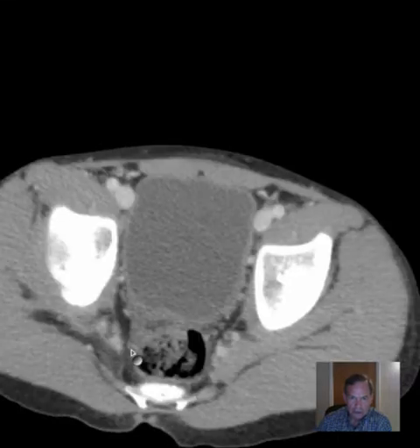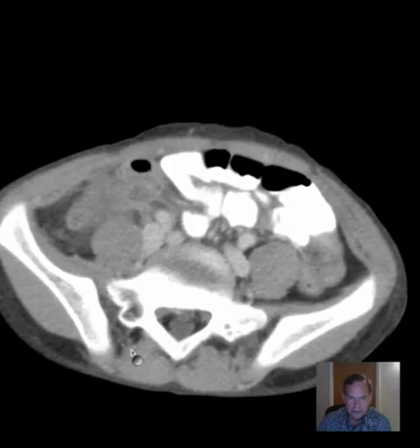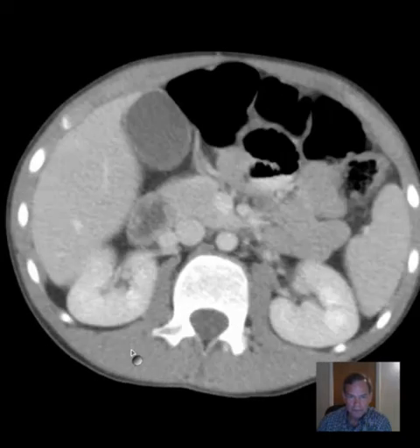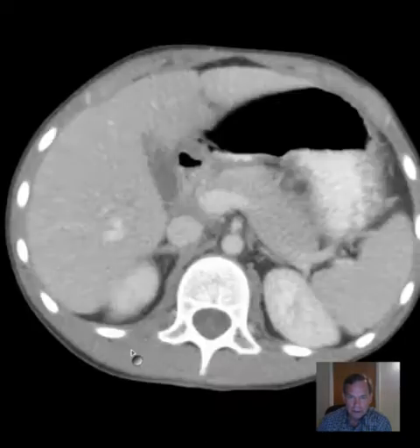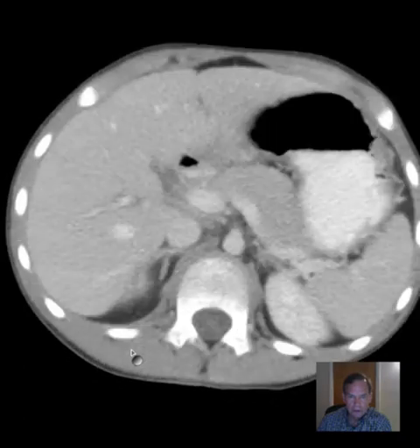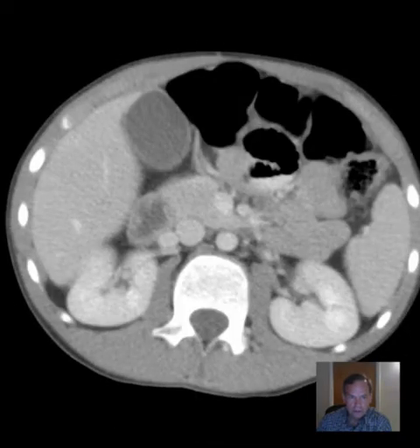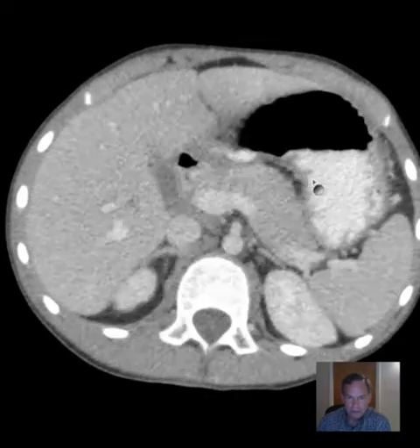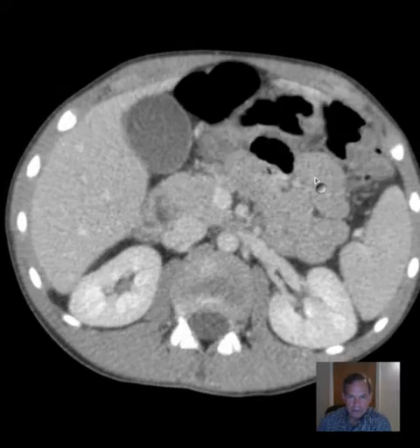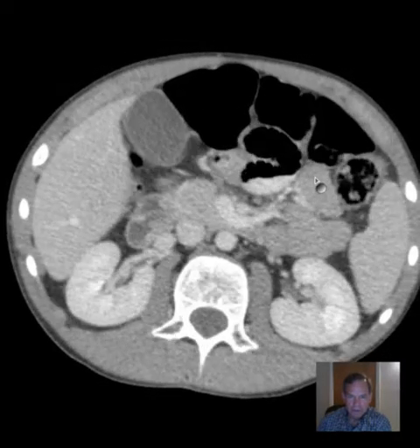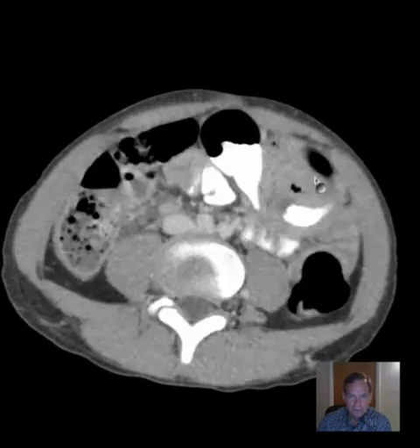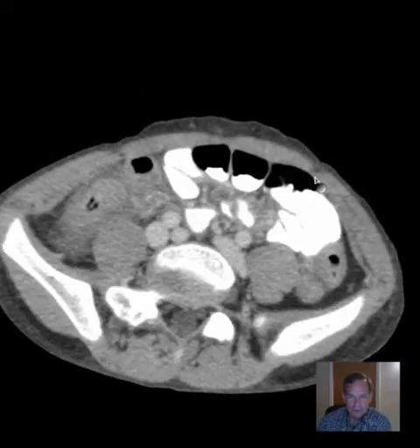I'll give you a chance to look over the case and get a general perspective on what we have here. I'll give you some high-resolution thin images. This is actually the mid-abdomen down through the pelvis. You can see these are high-resolution images.